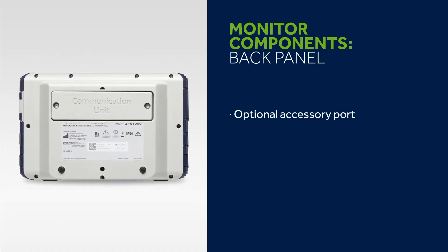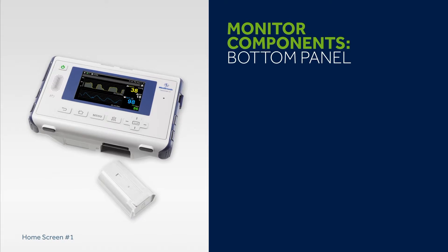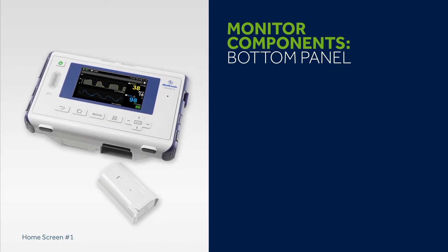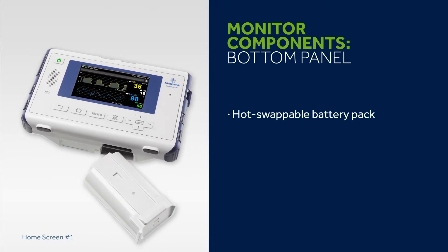The back panel includes a connector port for optional accessories such as a communications unit, and a panel with device information and serial number. Under normal conditions the monitor's internal battery provides power for up to 20 minutes. In addition, the bottom panel houses a hot swappable battery pack that can provide power for up to 3 hours.